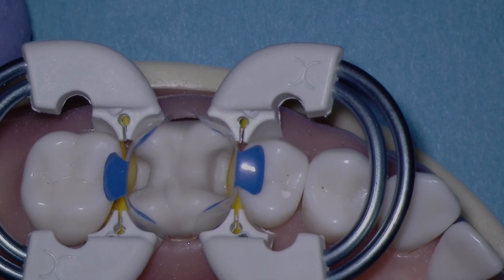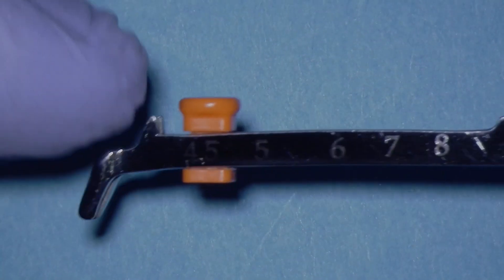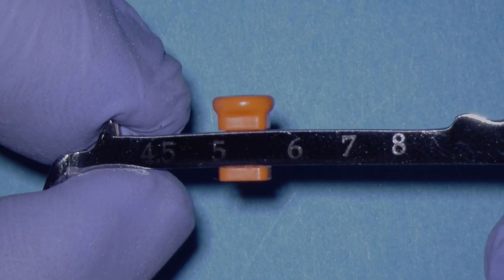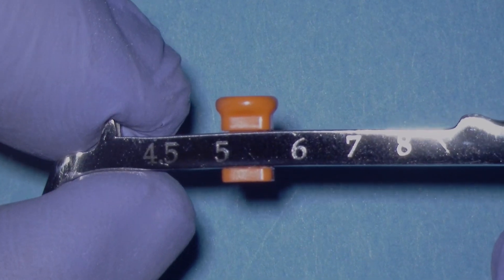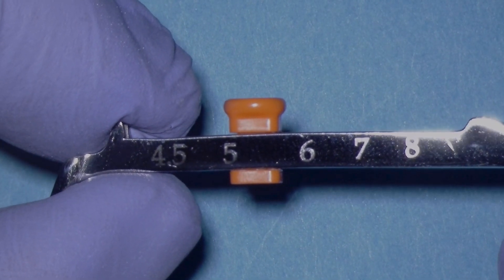Here we have the blue evolved matrix on a molar. For the blue evolved matrix, I'll be between 5 and 6, depending on what the neighboring tooth looks like. If it's a premolar next door, you don't want to expand the contact too much. In this case, I'll be at about 5.5, which is appropriate for this case next to a premolar.